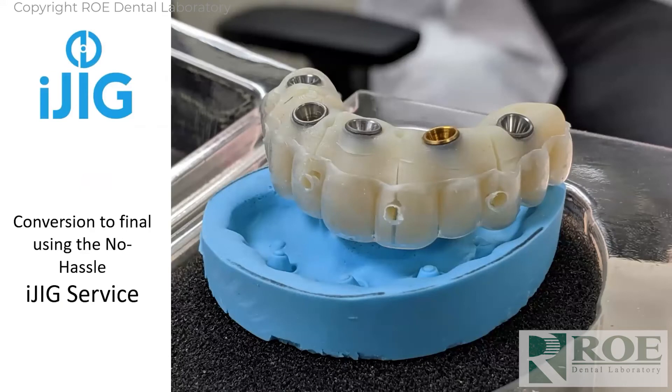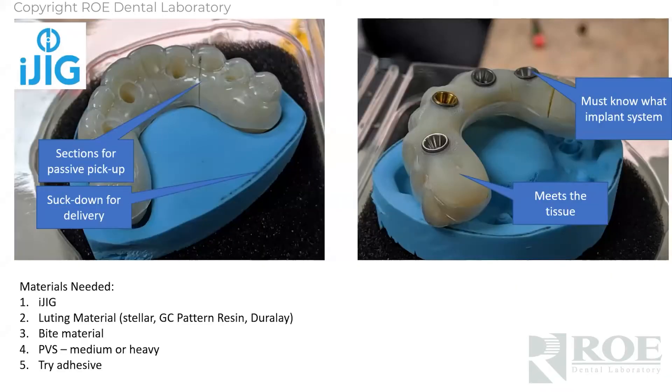The neat thing about the iJig is that it's sectioned, because we don't have an analog model to put the copings in — these are not coping-free yet. What you do is seat this in the mouth, make sure the sections are passive, and that each section has passivity between them. You can put dental floss through them, then do an injection procedure to lute them all together, followed by a reline impression with a little tray adhesive to capture any tissue gaps.